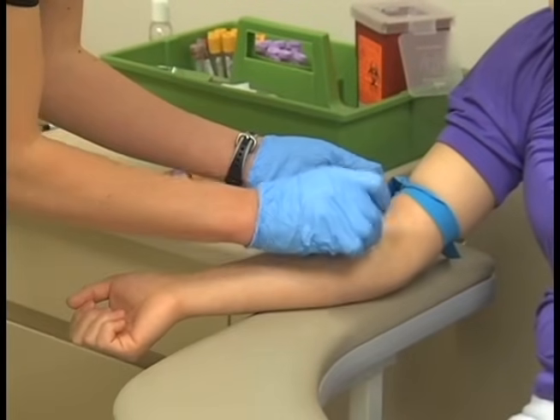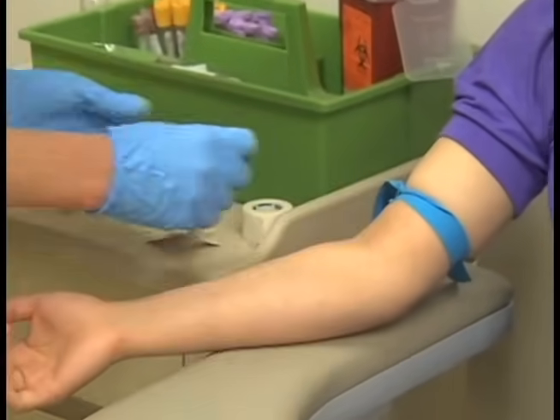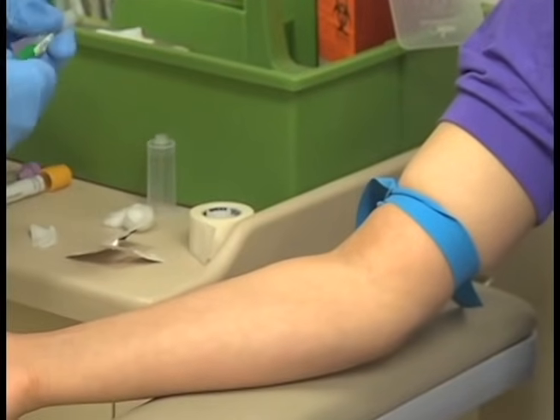A venipuncture should never be performed with the patient sitting on a stool or standing, as the patient may faint and injure themselves. If the patient appears nervous or has fainted in the past from venipuncture, it is best to draw the patient when they are in a supine or semi-reclined position.